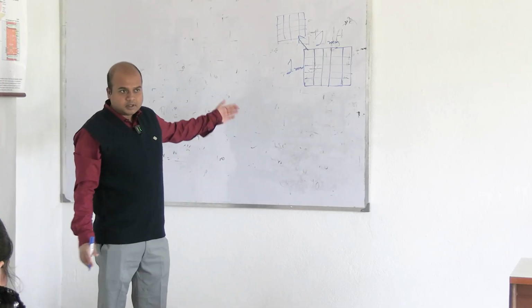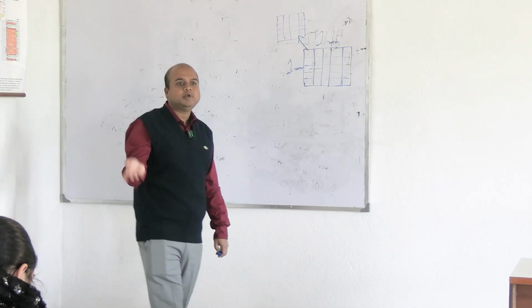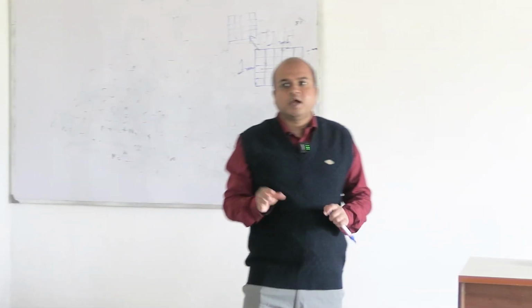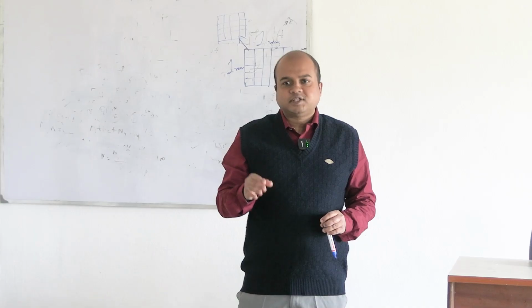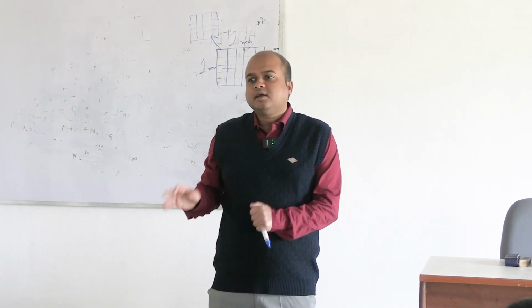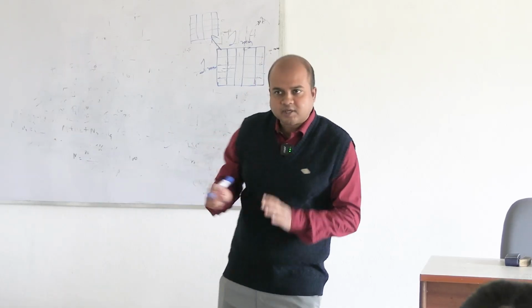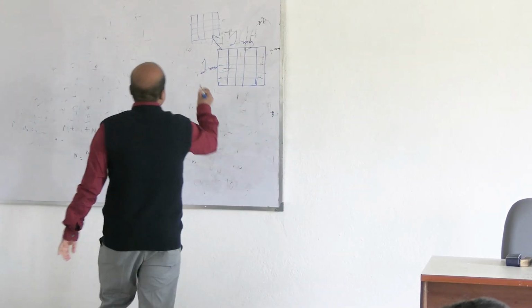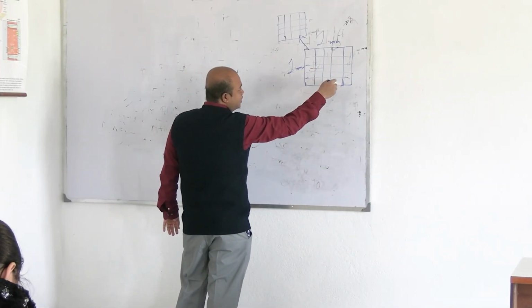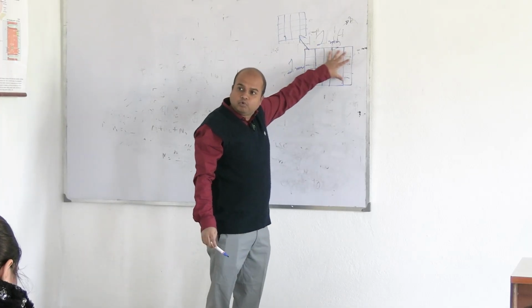So from here the calculation of volume of blood, as you have done in WBCs, that's why we did WBC first. The number of divisions of squares is less, and the theoretical part of the calculation is a bit simpler to understand. That's why we have done WBC first. Now we will be doing RBCs. In the case of WBCs, what we have seen is we are counting the cells in 1 mm into 1 mm square.